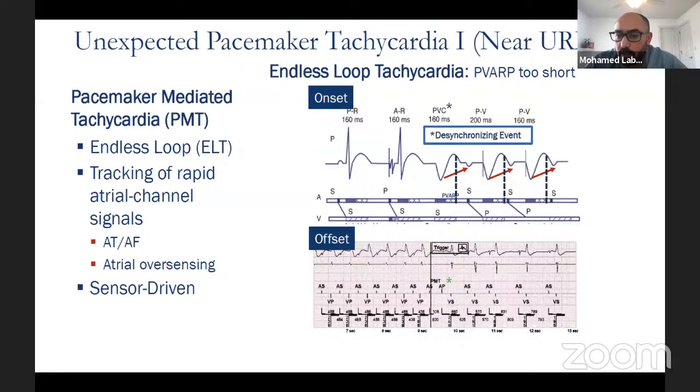We don't like to leave the abandoned pacing lead with the ICD leads, because of access issues, vasculature issues, data on increased risk of infection, and sometimes lead-on-lead artifact. So I try to pull the pacemaker lead out once I have the ICD lead in with good numbers.